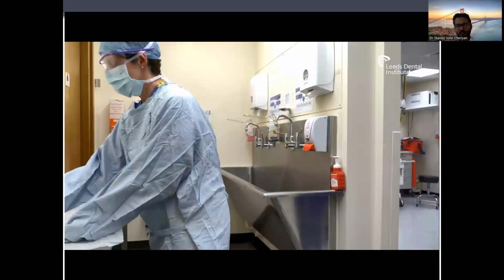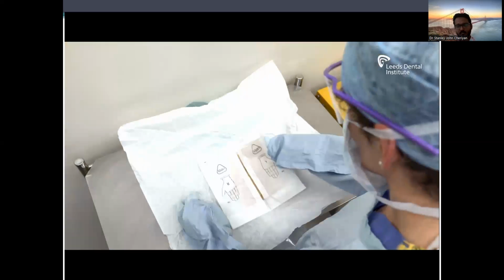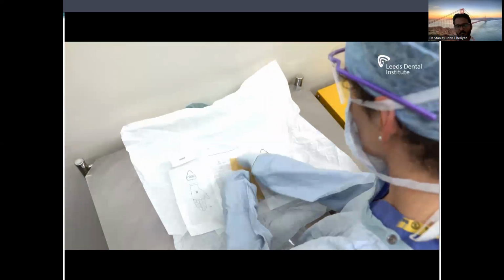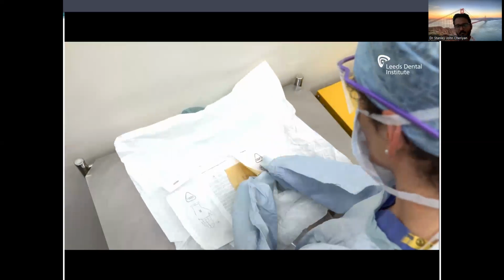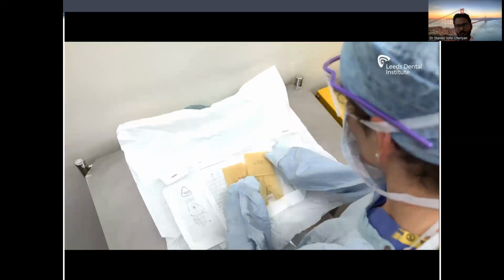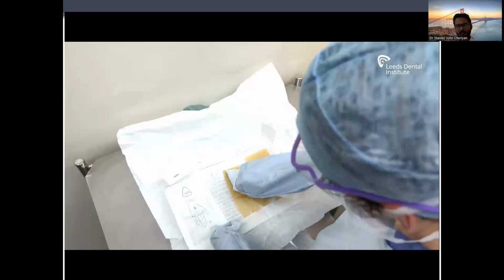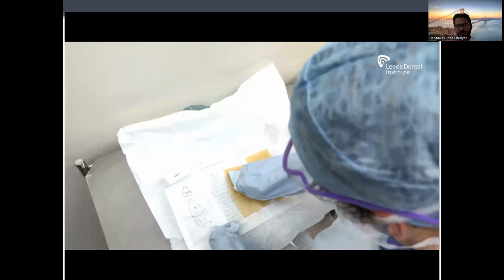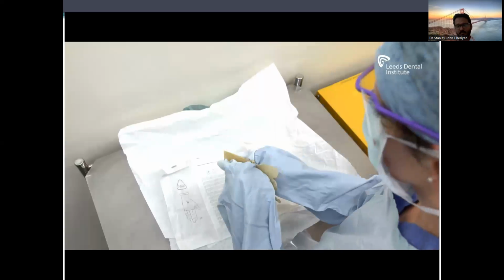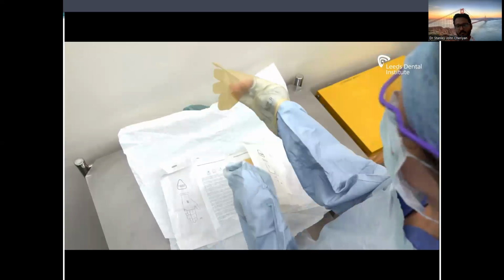Keep your hands within the sleeves of the sterile gown and draw the sterile glove pack towards you and turn it around. Open the pack so that the gloves are facing fingertips towards you. With one sleeve-covered hand, grasp with the thumb and forefinger the corresponding glove by the folded cuff edge, ensuring your thumb is aligned with the thumb of the glove. Using the other sleeve-covered hand to grasp the uppermost edge of the glove's cuff, stretch this over the back of your hand and straighten your fingers into the glove.